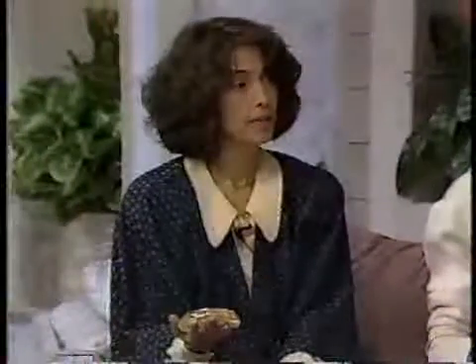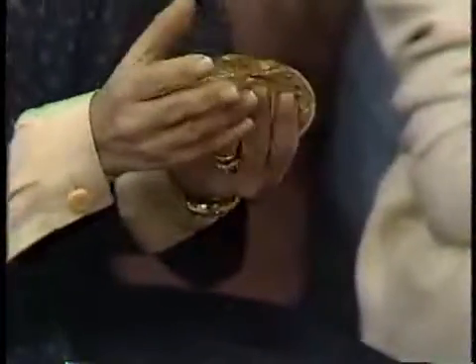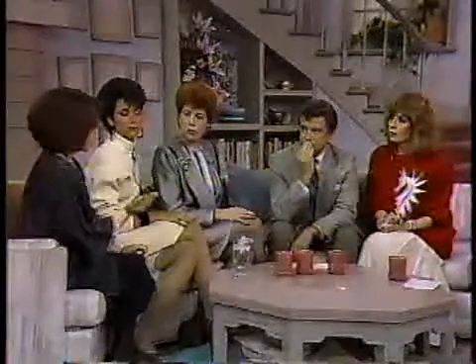The word silicone scares a lot of people. That's right. So you said silicone-like. This is not silicone? No, this is silicone, but it is semi-solid. It is liquidy, and it is in an envelope, so it does not leak. And you put this in under the muscle. You do not put it under the breast tissue.